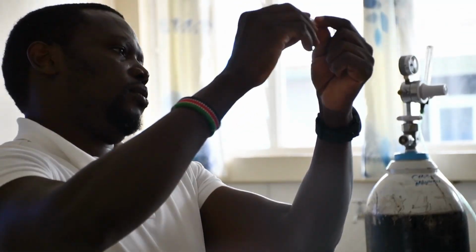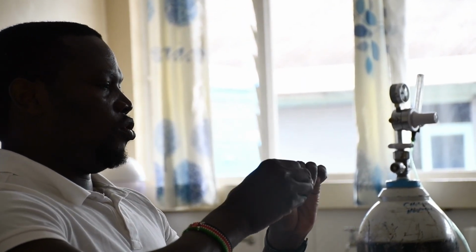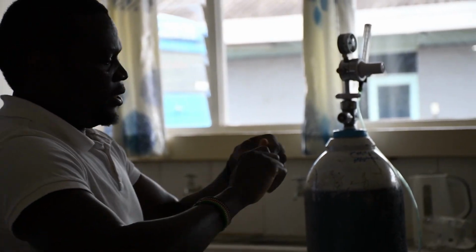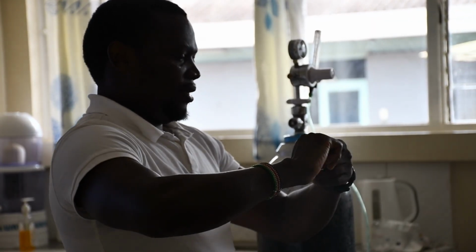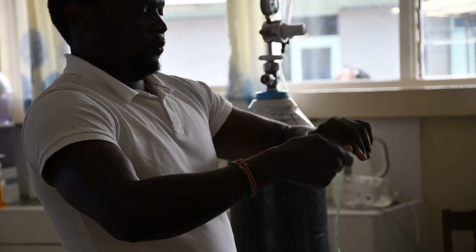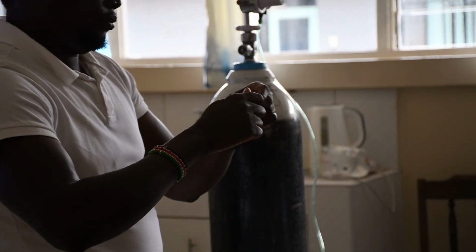So you see, you can let the elbows become a screwing point, yeah? Okay? So we want you to go in as if you're screwing in, yeah? And I want you to do it in such a way that just rotate it as if the same way, but a little bit of force. We want you to screw it until it goes to the very end of that elbow.